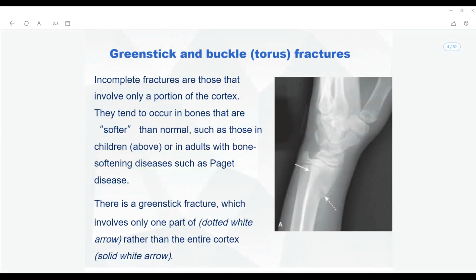When I'm looking at the abdomen, I only write an AP view. But when it comes to the skeletal system, you cannot just say PA view and that is enough. No, you have to write an AP view and lateral view, and if necessary, sometimes an axial view. You have to prescribe a musculoskeletal system radiograph in multiple views.